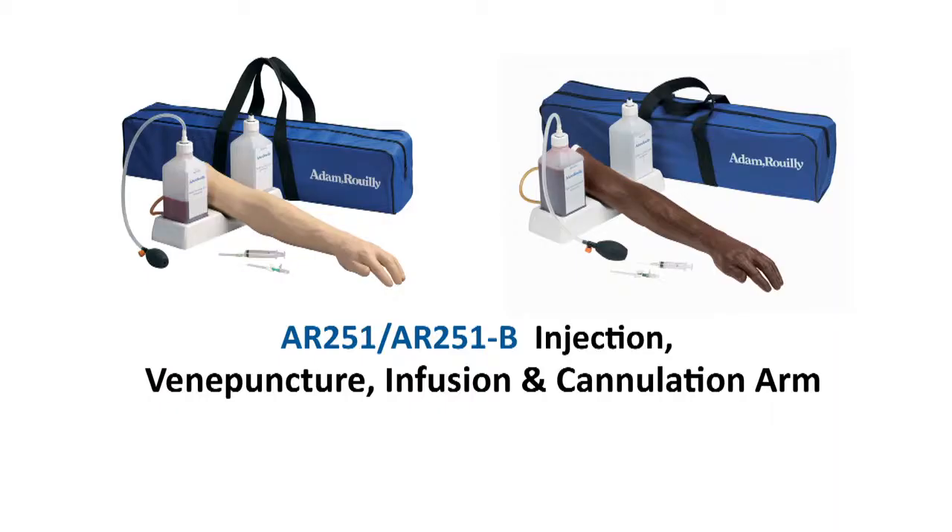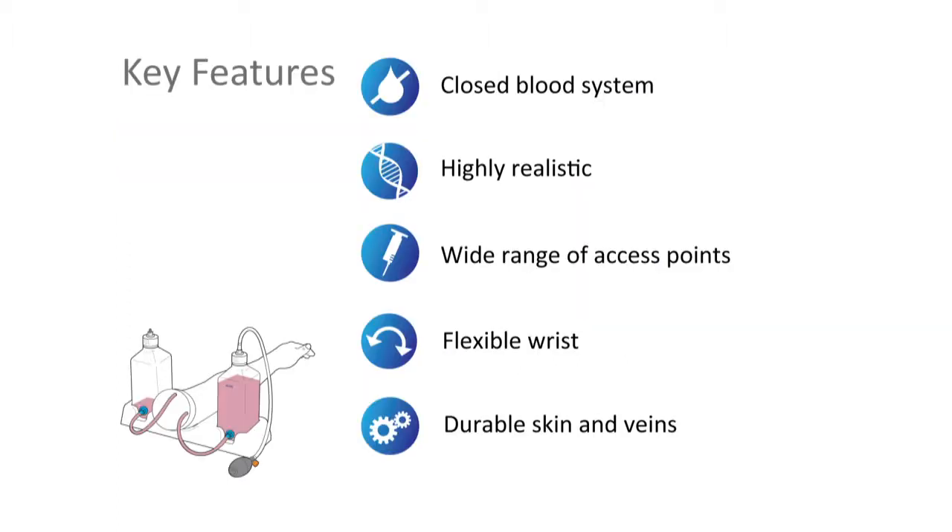The best-selling Adam Rooley AR251 injection, venipuncture, infusion and cannulation arm is a highly realistic and versatile trainer for vascular access. The model simulates a highly realistic left male arm with a wide range of access points in the antecubital fossa region of the forearm and on the back of the hand. The arm also features a flexible wrist for added realism, durable silicone skin and is simple to set up, operate and maintain.